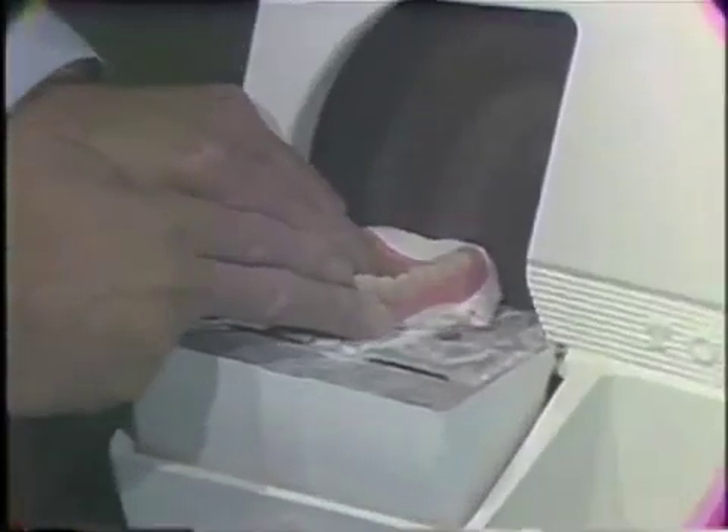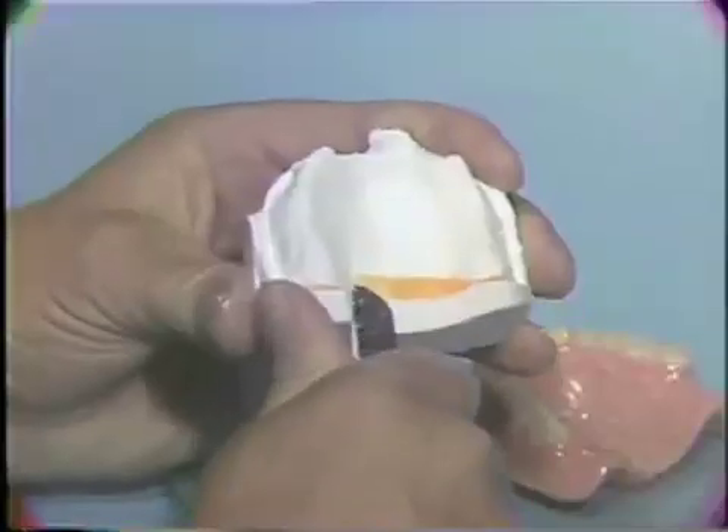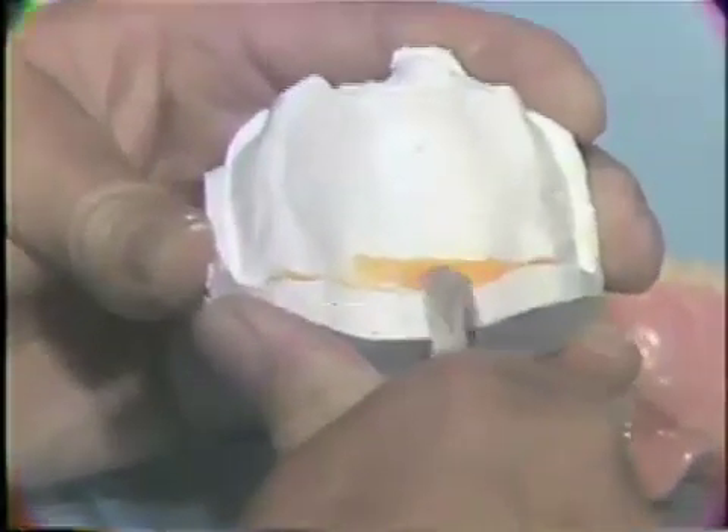Now, trim the cast with a model trimmer and the laboratory knife. Using the laboratory knife, place a trough at the midpoint of the impression plaster cast to act as an escape way for excess acrylic resin material.